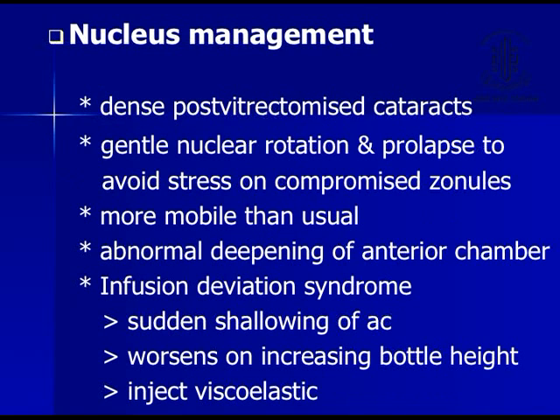Nucleus management. These vitrectomized cataracts are often dense. The nuclear rotation and also prolapse should be very gentle so as to avoid stress on the compromised zonules. The nucleus is more mobile and there is more deepening of the anterior chamber in these eyes.